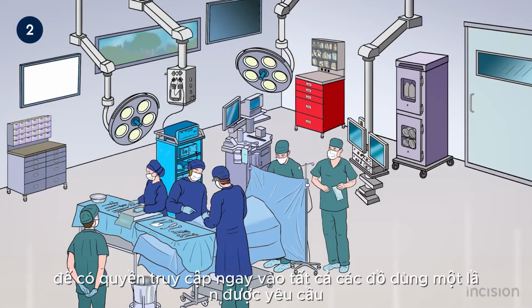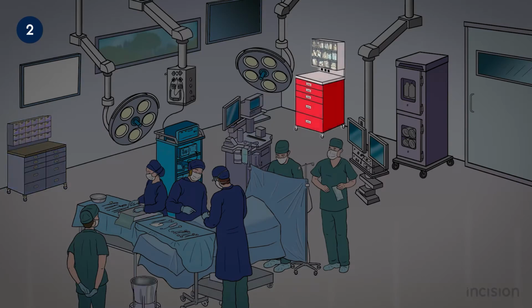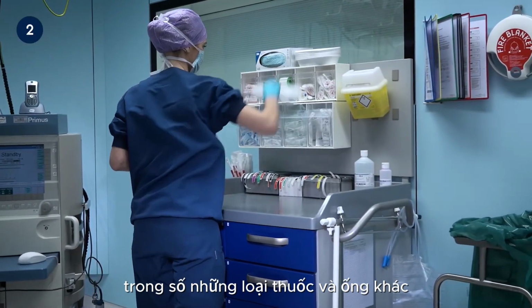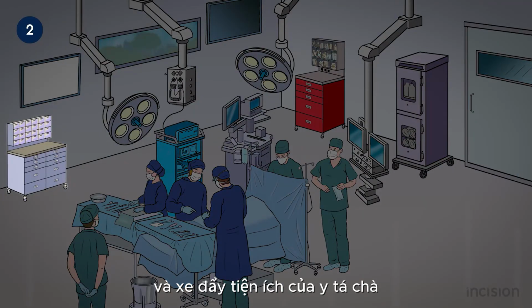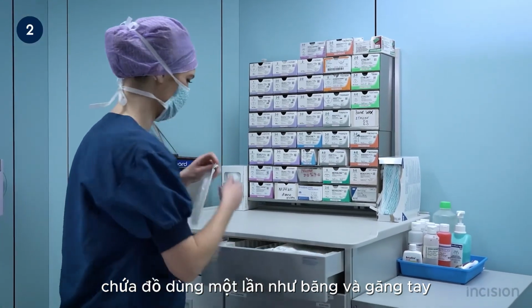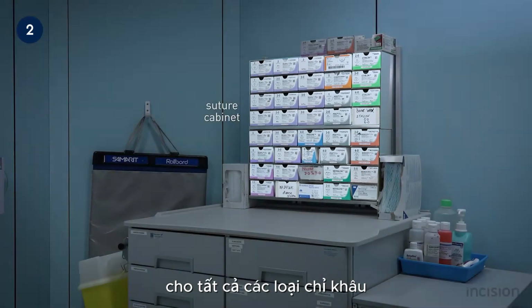To have immediate access to all required disposables during the procedure, a utility cart must be present in the OR. There are two utility carts. One for the anesthesiologist, containing, among others, medications and tubes, and the utility cart of the scrub nurse, containing disposables like dressings and gloves. A separate cabinet is often present for all types of sutures.